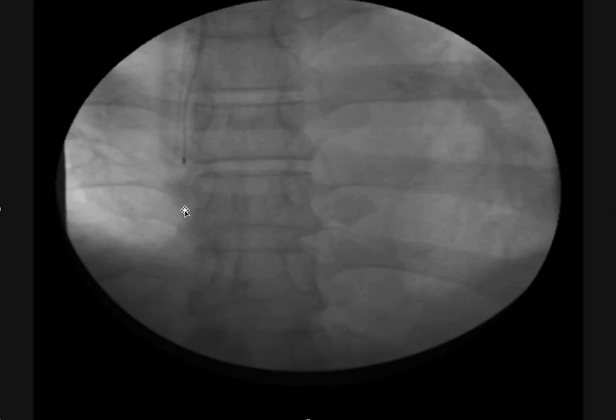So I hope this is helpful. Again, the two things that I found, the mistake that I made over and over again, was when I was trying to grab the lead, having the inner sheath too far forward, and then once I had the lead successfully snared, not locking it tight with that Kelly clamp to prevent it from being released.